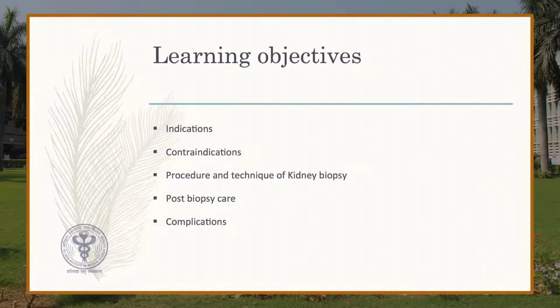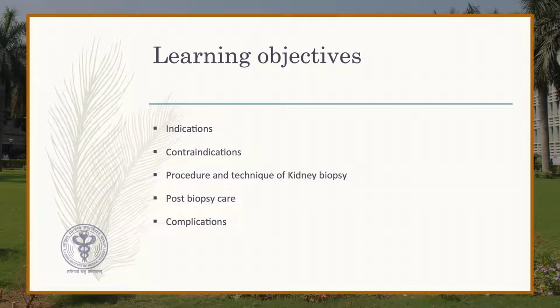At the end of this video, you will be able to enlist the indications and contraindications of kidney biopsy, understand the procedure and the technique of kidney biopsy, post-biopsy care, as well as biopsy-related complications.